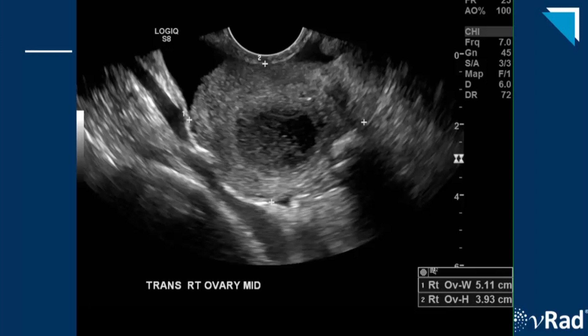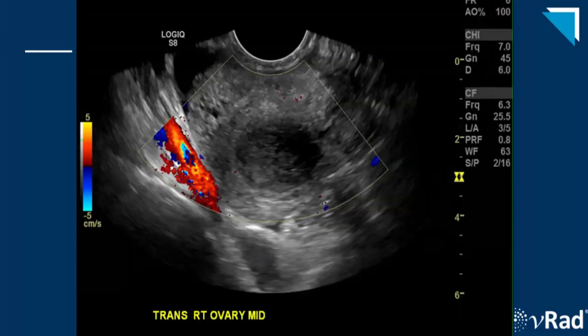The color Doppler from the same section of the ovary shows no internal flow. Remember, the finding of no internal flow is best seen as a marker of non-viability. If we wait to call torsion until there is no internal flow, we would not salvage a single ovary.